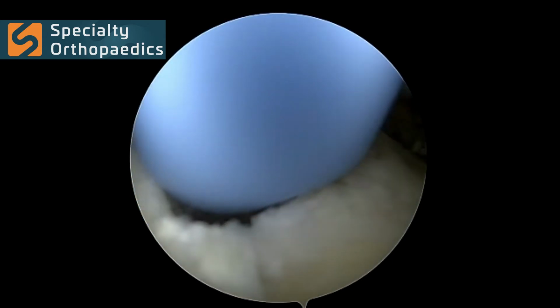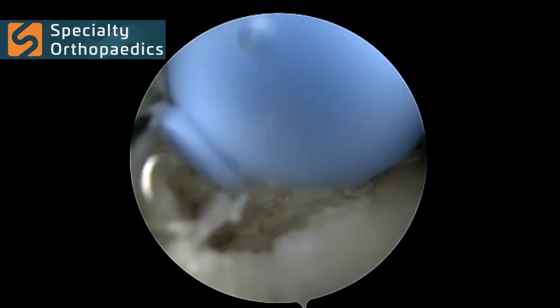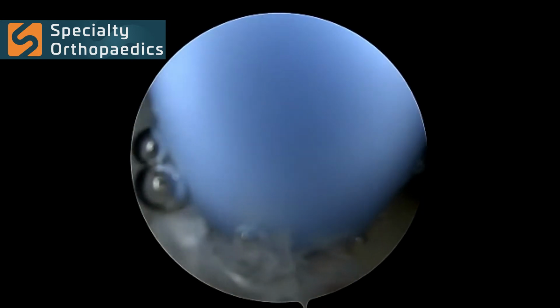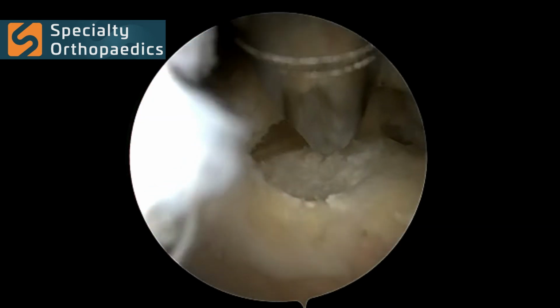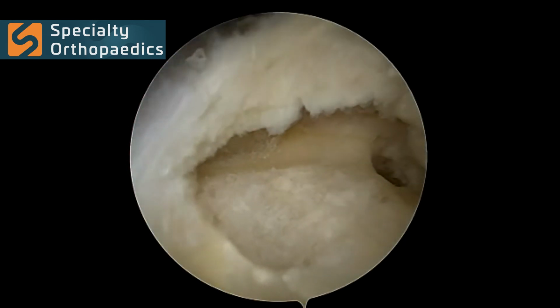I then proceed by inserting the cannula through a superior lateral portal and then directing the cannula directly over the lesion. Once in position, we use the trocar for the cannula to push the bone graft down the cannula and into the lesion site. A blunt trocar or bone tamp can then be inserted and used to impact the bone graft further within the cyst.